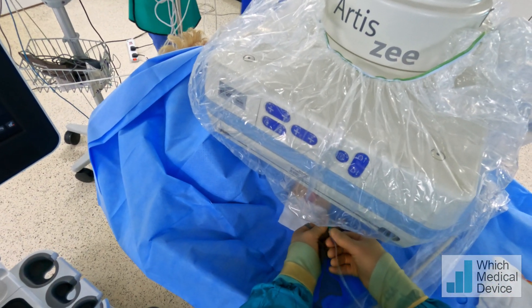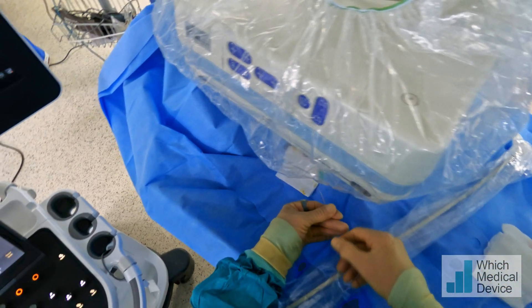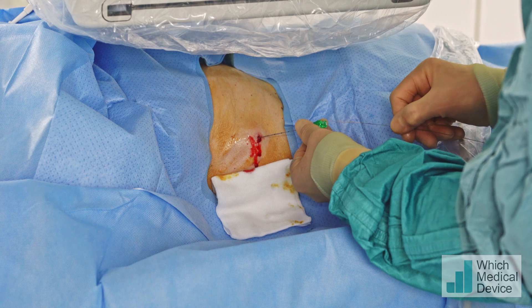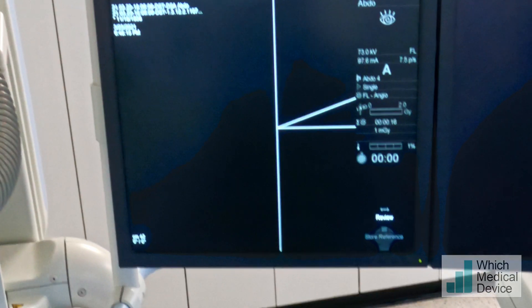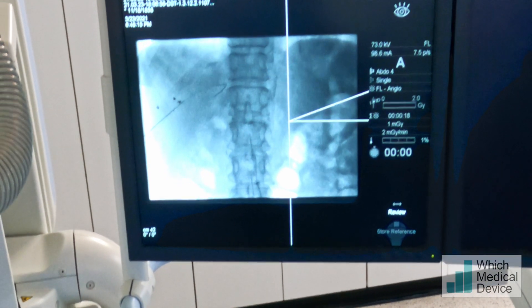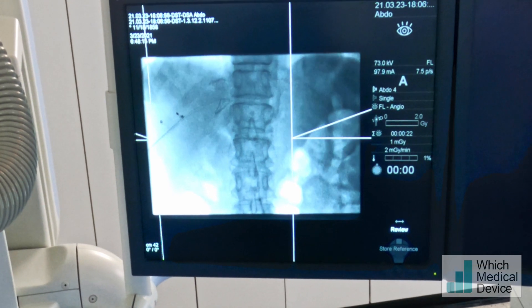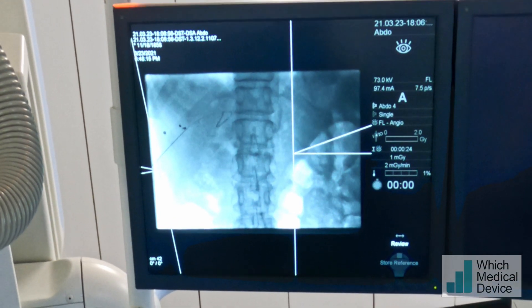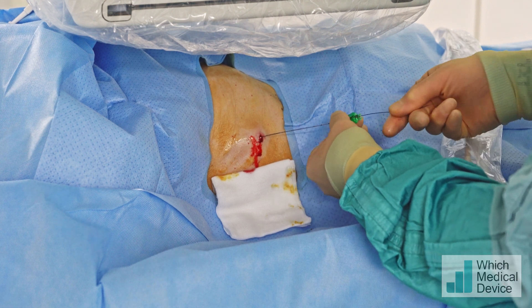Let's have the guide wire now please. This is an 018 wire that comes with the Goldstick. We're just going to pass this in through the needle, and hopefully it's just going to fly down the portal vein — it will probably go into branches along the way. Okay, we've got the supportive part of the guide wire in, and I'm going to take the rest of the Goldstick now.